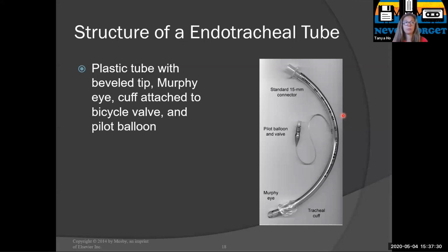Because let's say the person was in a fire or something happened, and you say at the lip, and the next day their lips are out to here, or there's some kind of massive swelling going on. Now your measuring is unreliable, okay? But your teeth and your gums always stay in the same spot, so you have to measure it that way.